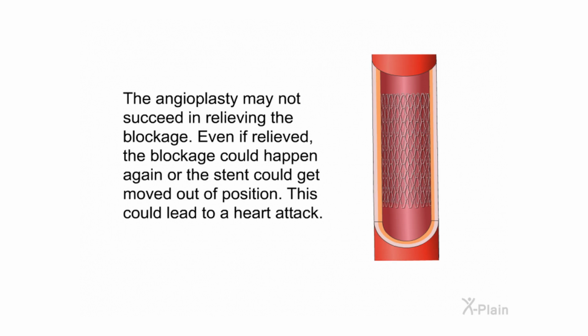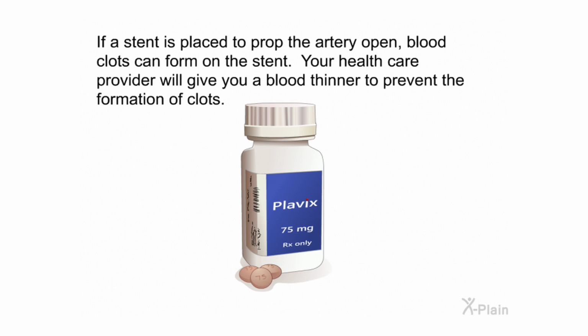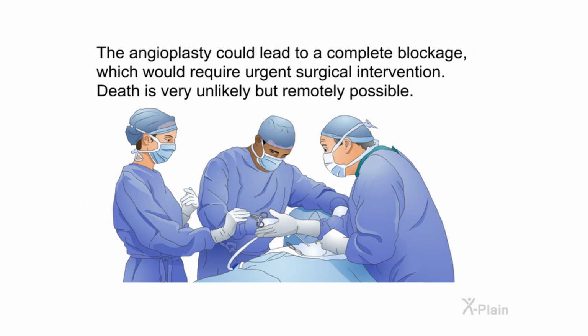The angioplasty may not succeed in relieving the blockage. Even if relieved, the blockage could happen again, or the stent could get moved out of position. This could lead to a heart attack. If a stent is placed to prop the artery open, blood clots can form on the stent. Your healthcare provider will give you a blood thinner to prevent the formation of clots. The angioplasty could lead to a complete blockage, which would require urgent surgical intervention. Death is very unlikely, but remotely possible.